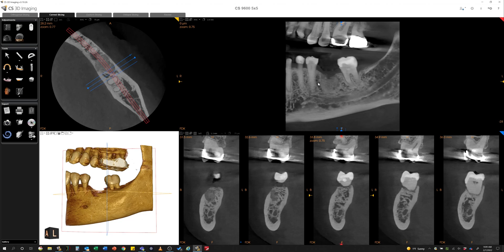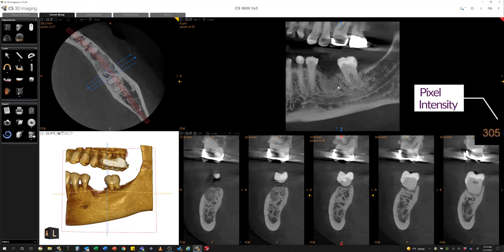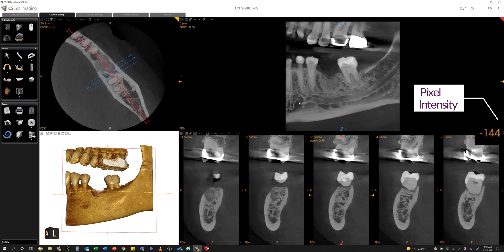Basically, what this is is what we call pixel intensity. In the lower right section of this workspace, we can see a numeric value that changes as I move the cursor through the radiograph. As I move it down into the canal, we can see that number get lower. As I move it into less dense bone, that number gets lower and even goes into the negatives. And as I move it over a tooth, we can see that number get much higher. So the higher the number, the denser the material — that's what it's supposed to correlate to.